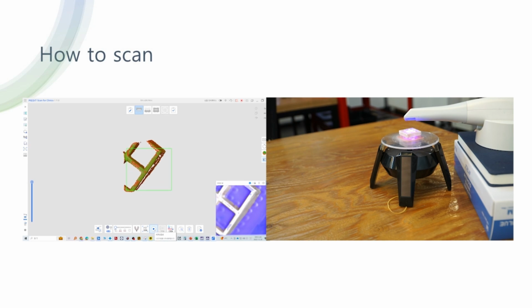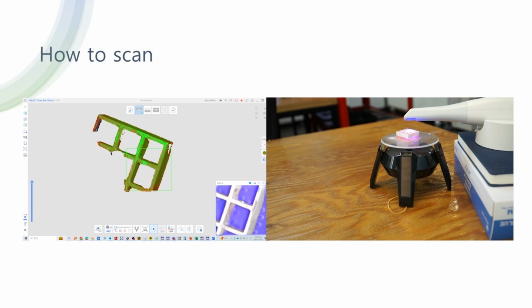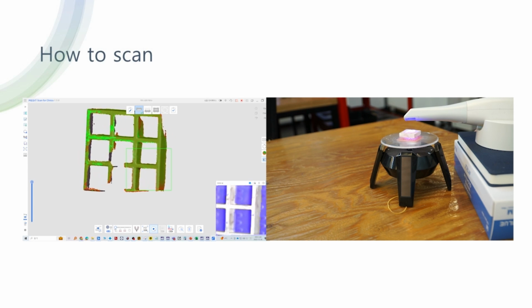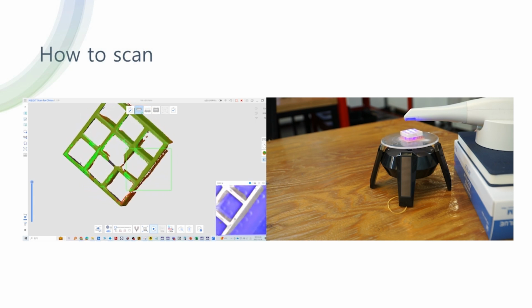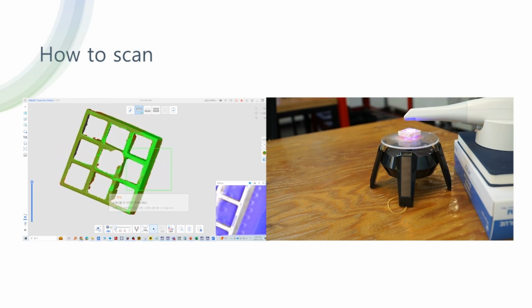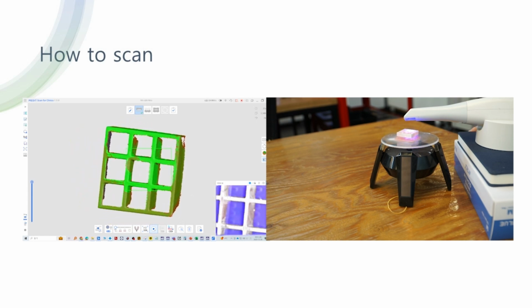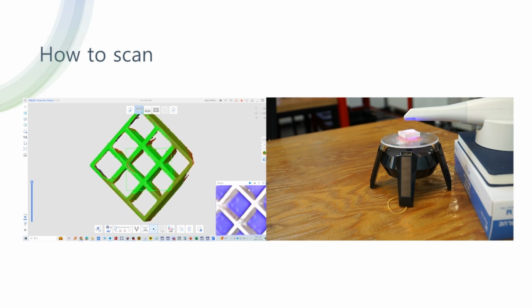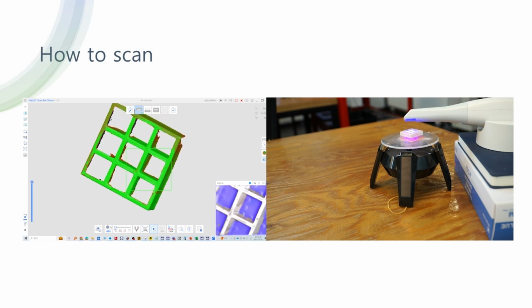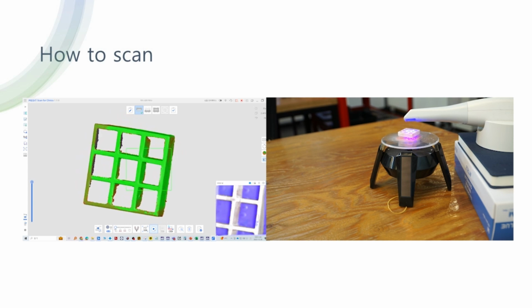In this section, we will focus on the scanning process, which is crucial for verifying the accuracy of 3D printed models. Initially, we print the model with the set scale, followed by a post-curing process. An important step to note is the cooling time post-curing, which is essential for the model to stabilize and for its final dimensions to be established. Although using a model scanner is the most accurate method for scanning, a dental scanner can also be employed effectively. We recommend placing the model on a turntable and securing the scanner for this process.